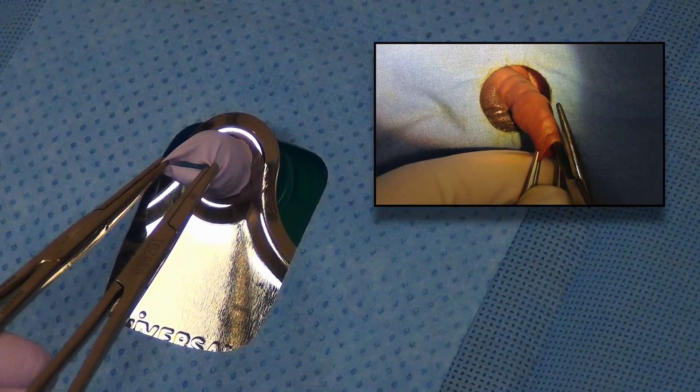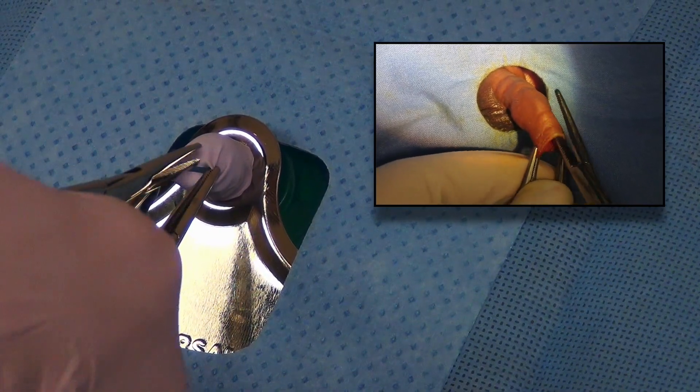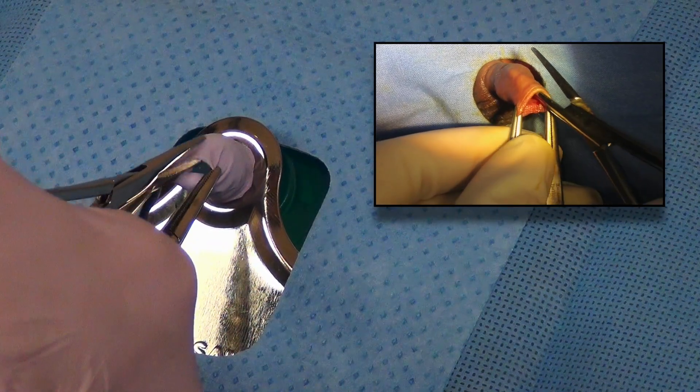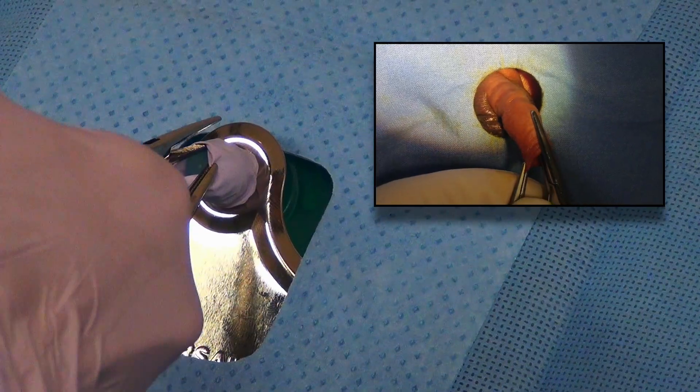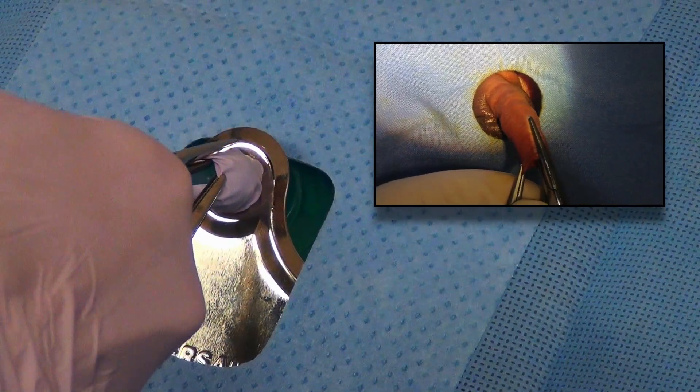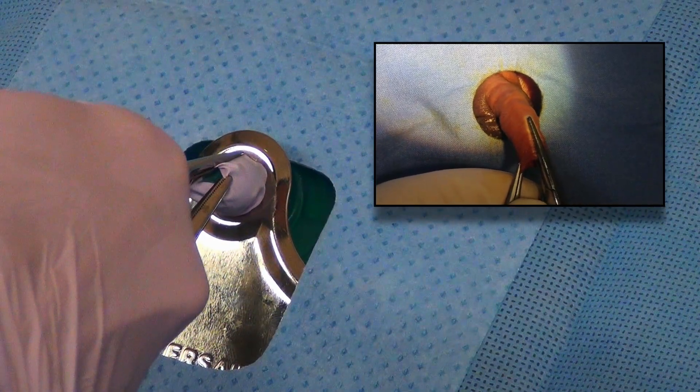Adhesions between the glands and the foreskin are broken up with a hemostat. The amount of foreskin to be removed is then marked by crushing the dorsal aspect of the foreskin just above the corona.